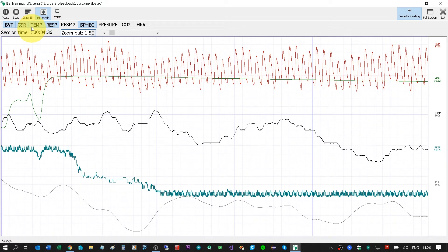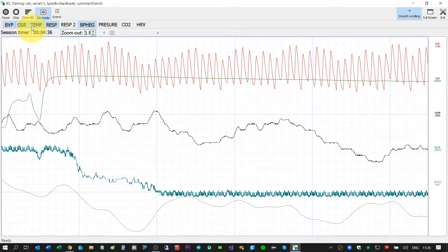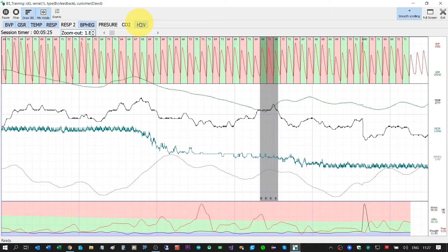Marking events can be done with any key on the keyboard. For example, I will click Events, then click the B button — you can see here the gray area indicating that I clicked the B key. I can also close and resume the training. To see the HRV, I will click here for four seconds and see the HRV display.